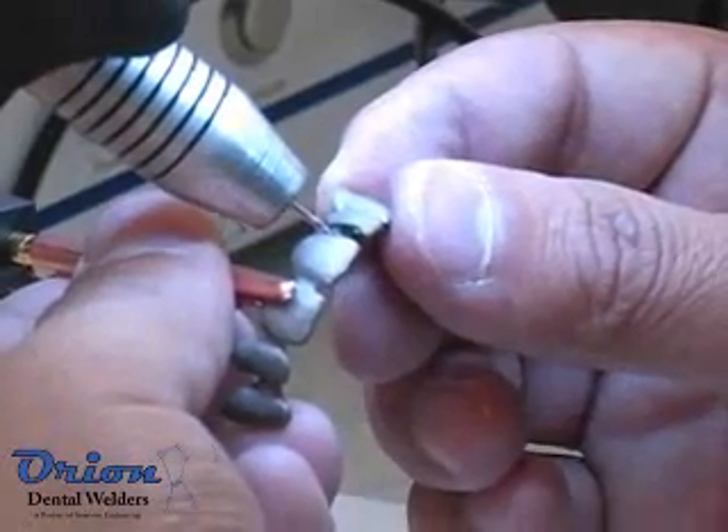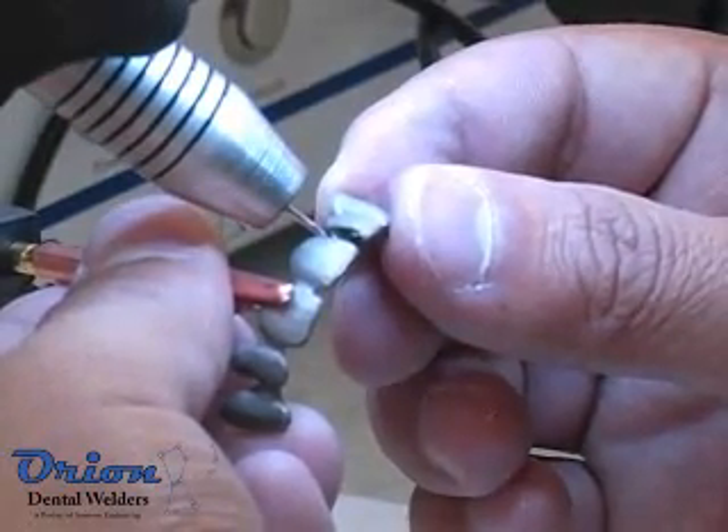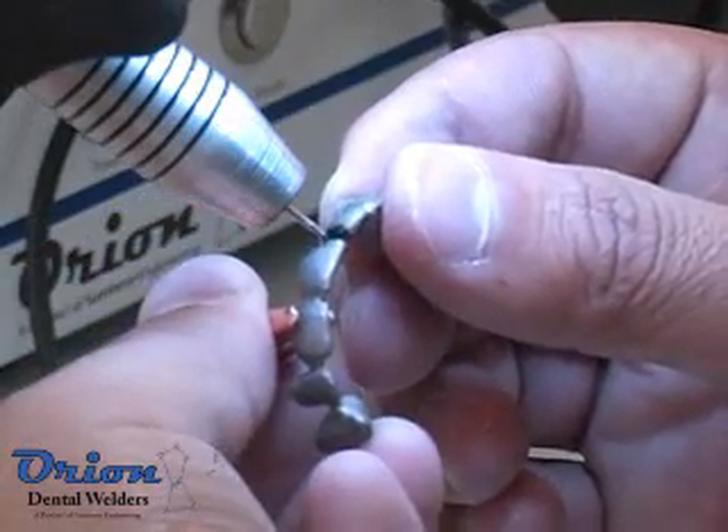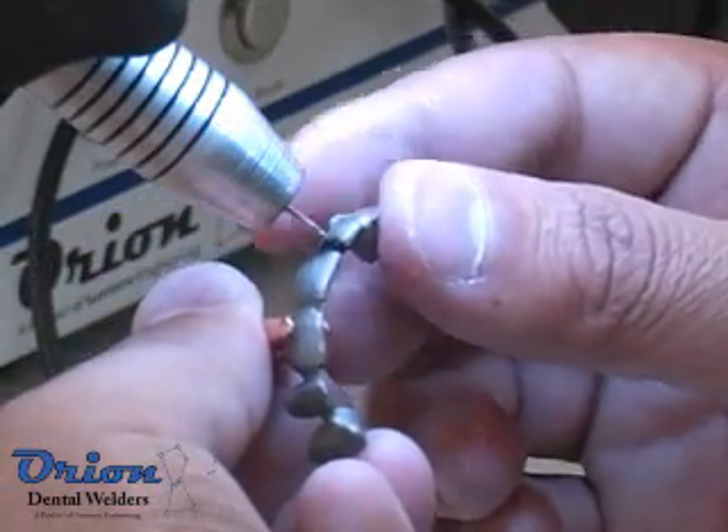In Pulsark mode, the welder has 175 watt seconds, or joules, of energy. Use this mode to weld larger seams or to make Pulsark spot welds.